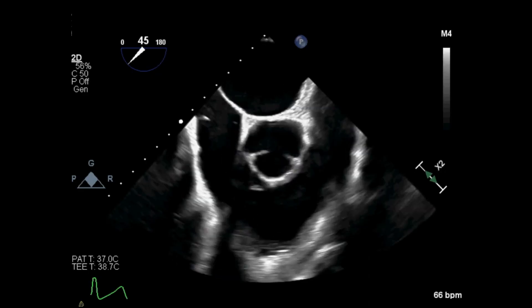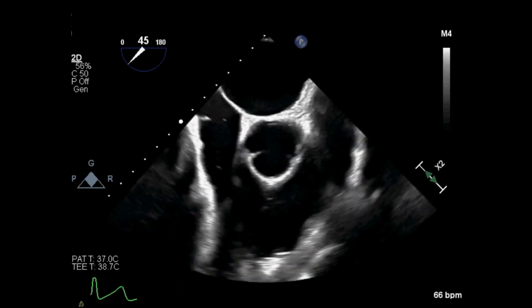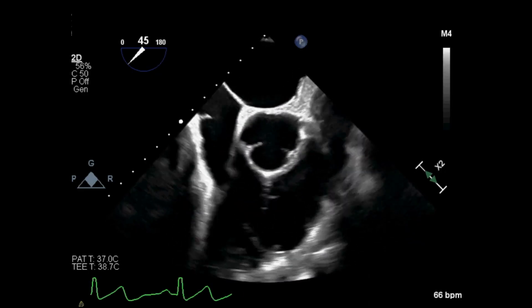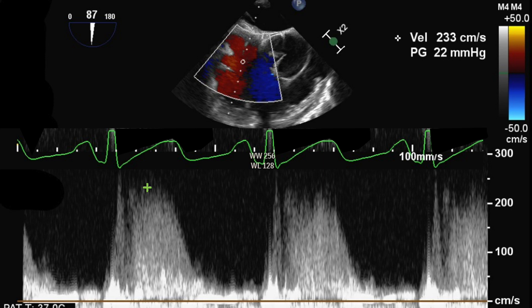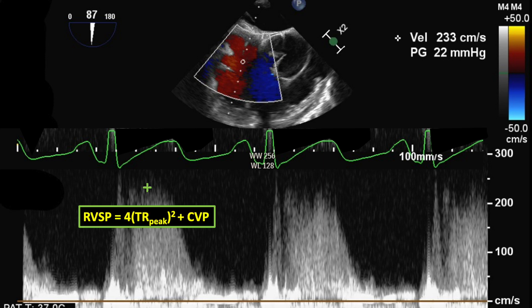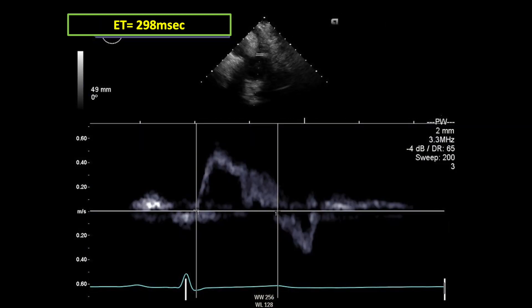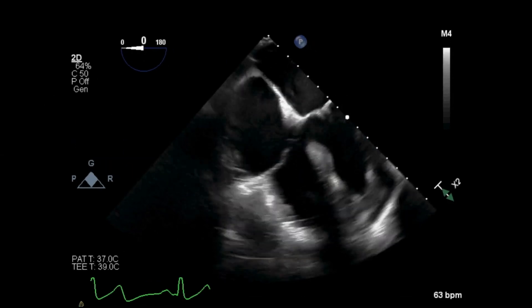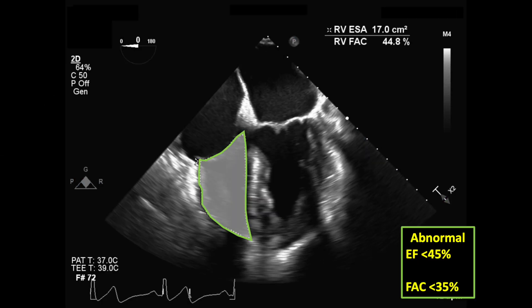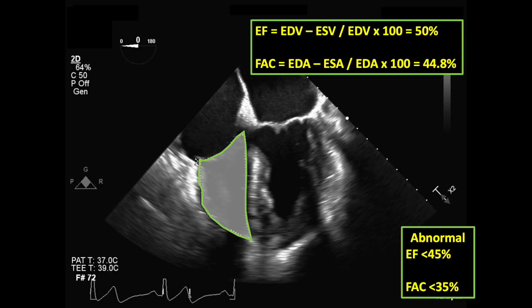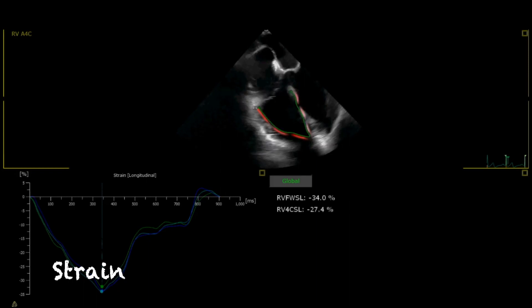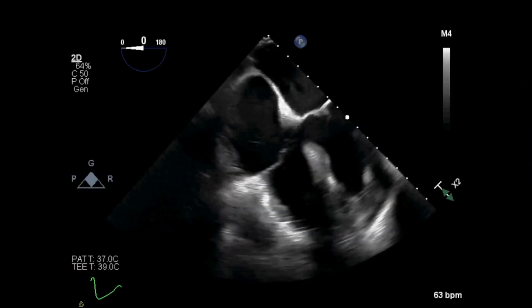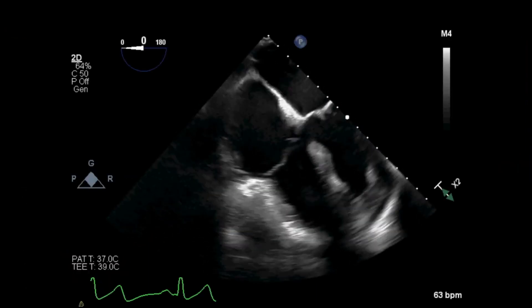From here, I look to the right ventricle's inflow and outflow view. If there is significant regurgitation through the tricuspid valve, I calculate the right ventricle's systolic pressure and further its myocardial performance index. Back in the mid-esophageal four-chamber view, I calculate the right ventricle's fractional area change and assess strain. I measure the tricuspid annular diameter and free wall thickness.